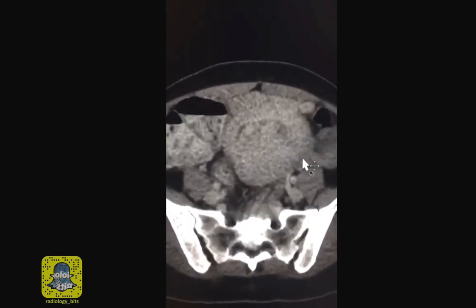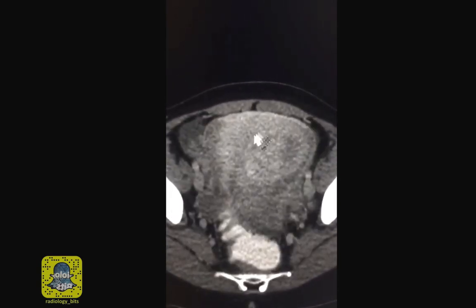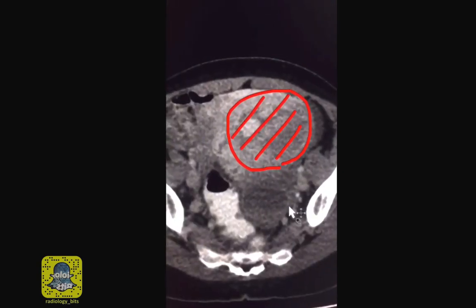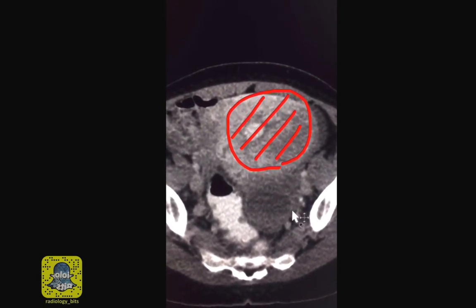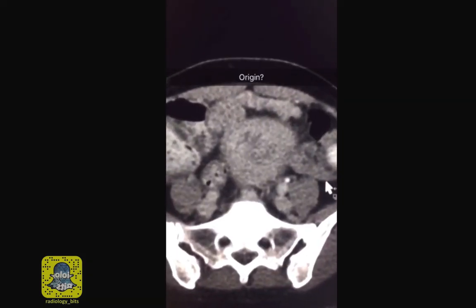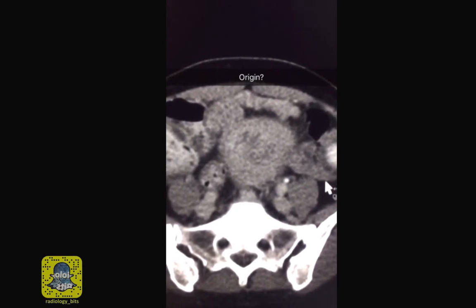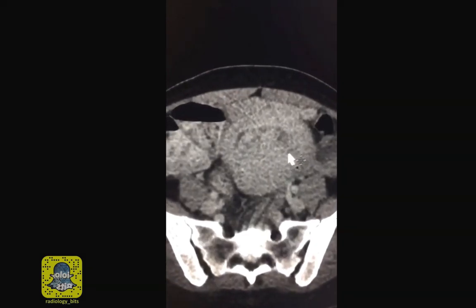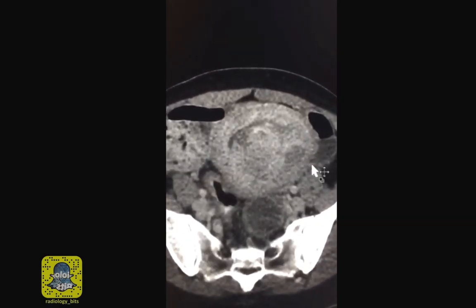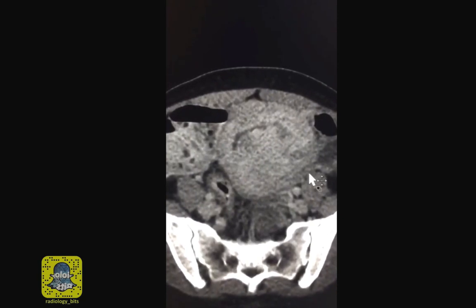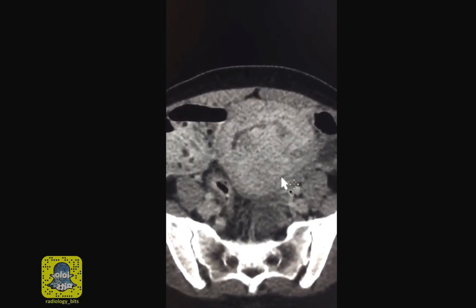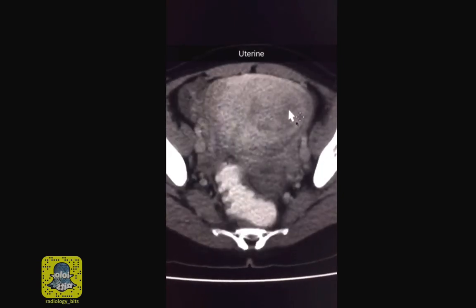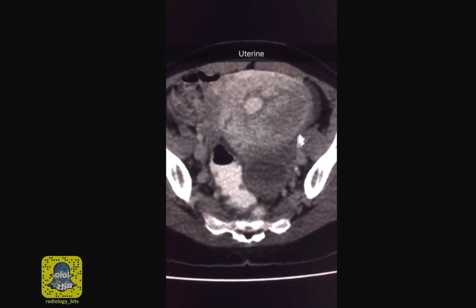As we go lower down in the scan you'll notice a large heterogeneous pelvic mass. A general rule for residents is that if you see a pelvic mass you have to decide where it originates from — is it arising from the uterus, the ovaries, the adnexa, or from adjacent structures? In this case this is your uterus, and the case shows an abnormality that arises from the uterus, so this is uterine.